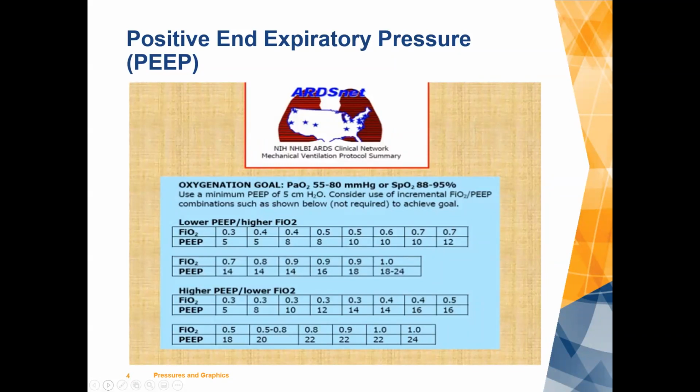The final thing is that we had found that of our ventilator associated events, VAEs, so I'm just going to paraphrase the definition of a VAE. It's not a VAP, but it's like a precursor to it. It's like VAP light. It's really identifying patients that may be headed towards developing a VAP, where their oxygenation needs have gone up abruptly. And it really looks at an increase after a period of stability on the ventilator, an increase in the FiO2 of 20% or more, or an increase in PEEP of 3 or more.